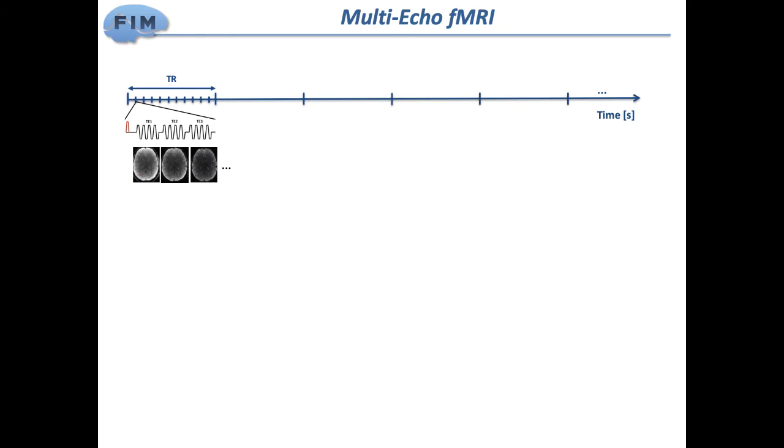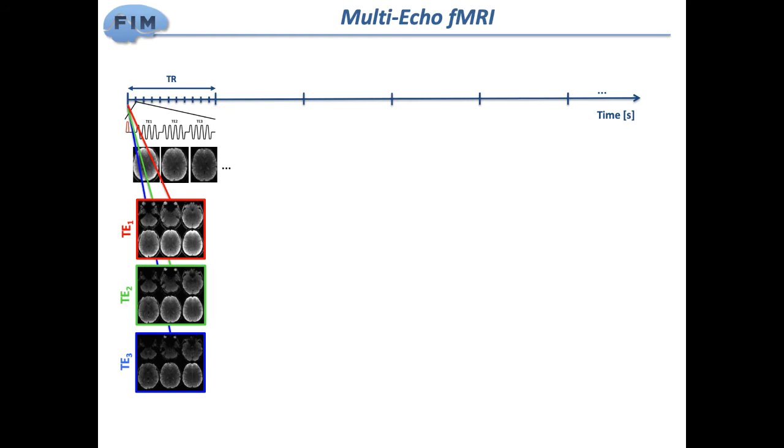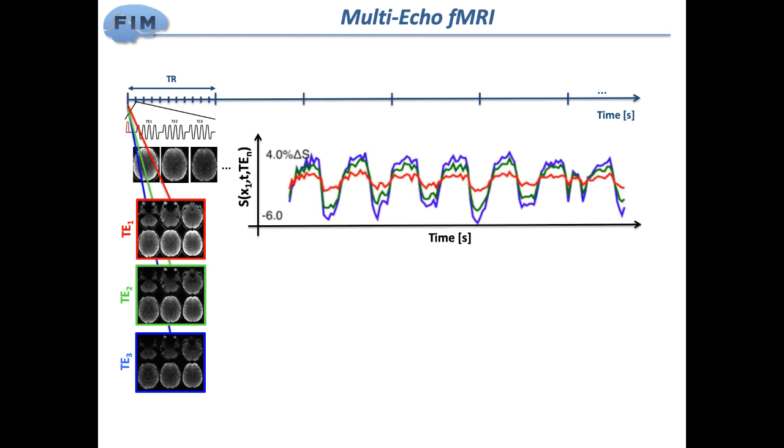Multi-echo, what we're going to do is instead of just reading out once, we're going to be reading out several times. In this particular case, 3 times. So what this means at the end of the day is that we're getting more than one time series per voxel. We have pseudo concurrent estimates or measures at different echo times, and not only do we have more data, but we have several traces per voxel that differ in what hopefully will convince you are interesting ways that would allow us to separate what are fluctuations of interest from what is noise, and hopefully in a pseudo-automated manner.